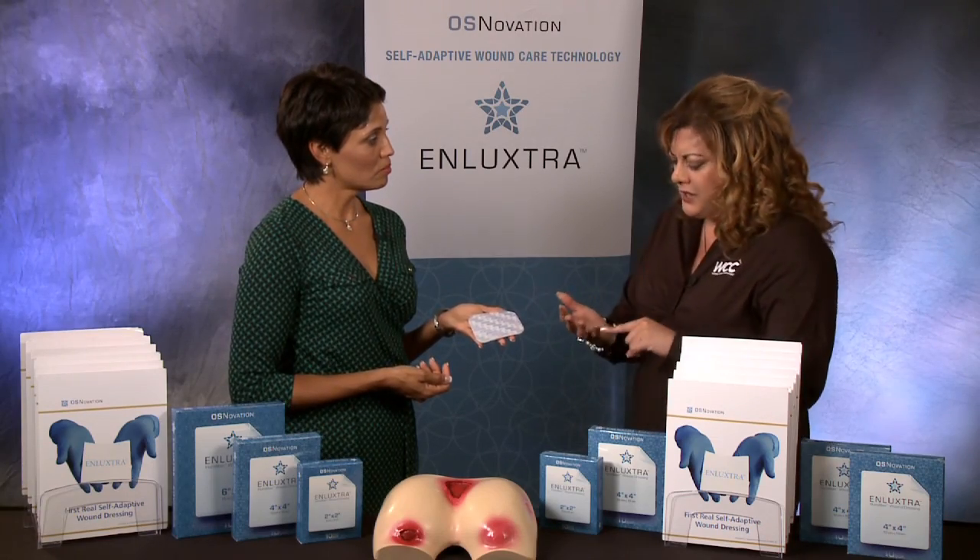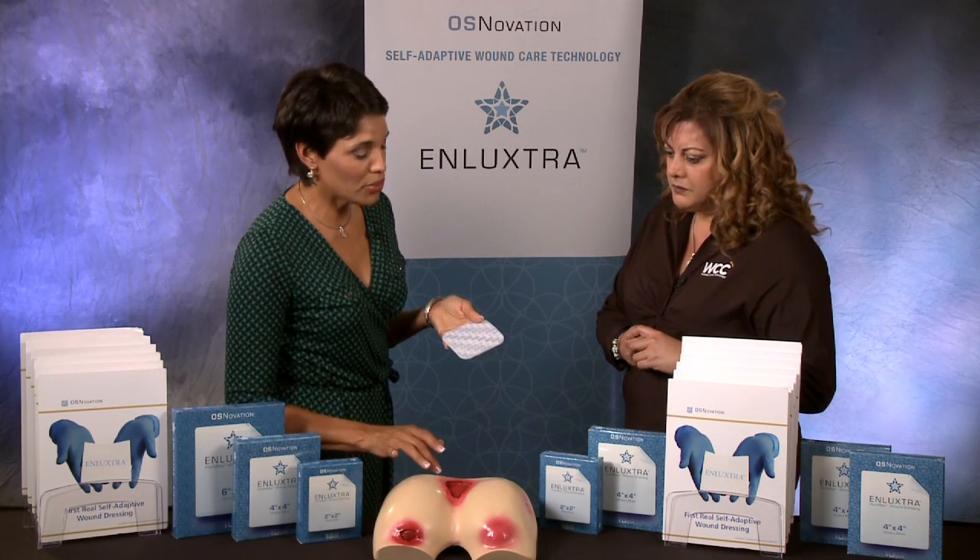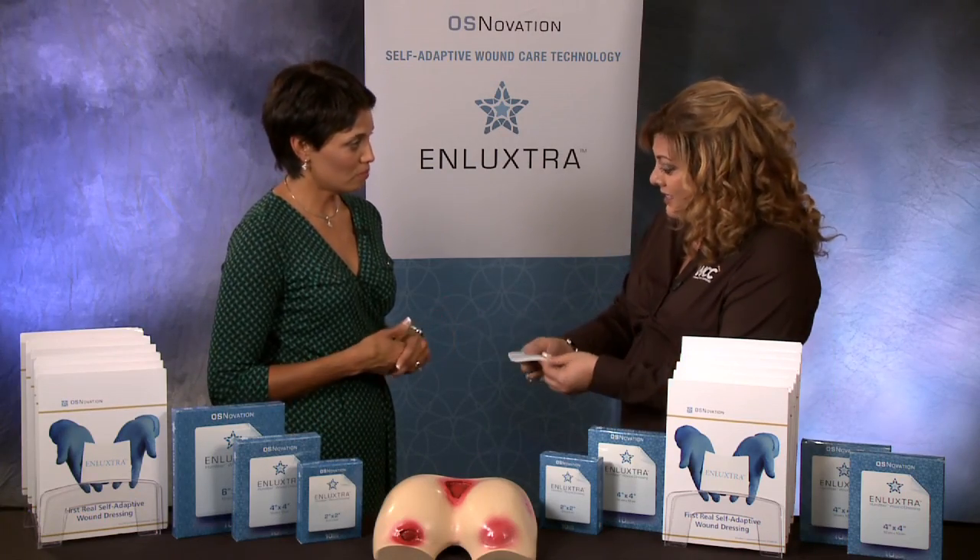So this product can be for any wound — venous, arterial, diabetic, pressure ulcers. Some have drainage, some do not. How can one dressing meet that need? This is a self-adaptive dressing. What it allows is to draw up drainage but also donate fluid to dry areas. You're not going to over-dry the peri-wound area, nor will it macerate it. If sized appropriately, it's extremely effective. So it has the ability to sense — if part of the wound is moist it absorbs drainage, and if the other side is dry it donates moisture, all within the same dressing. Correct.